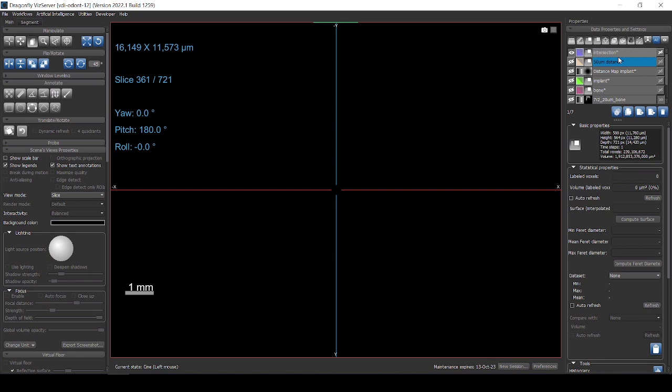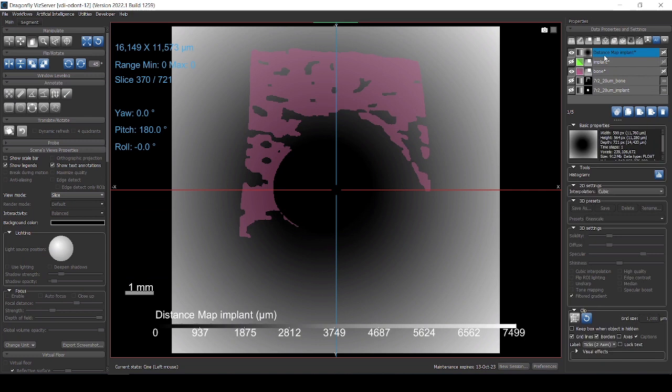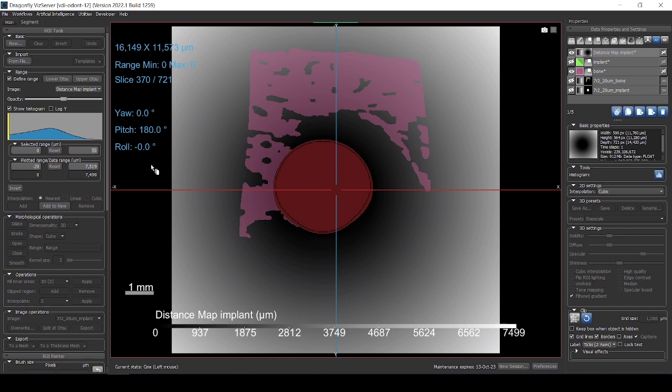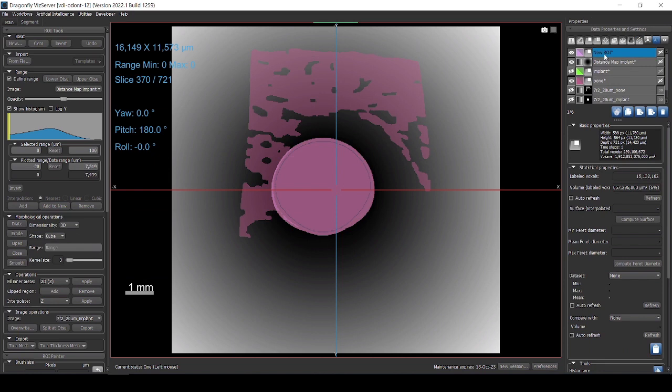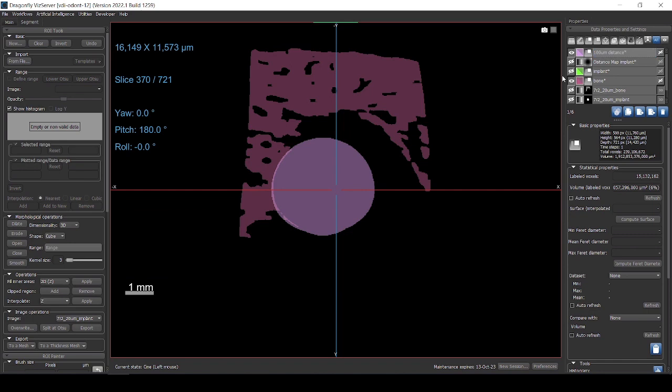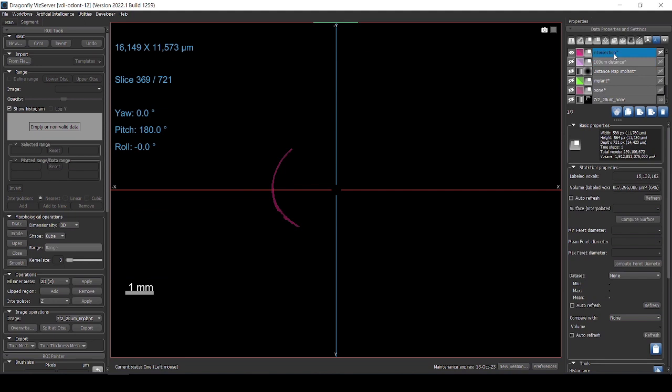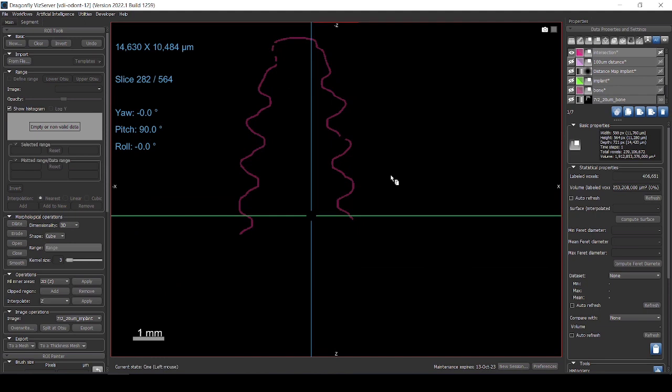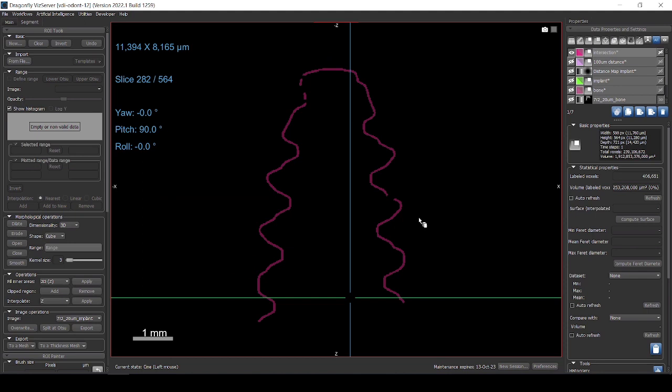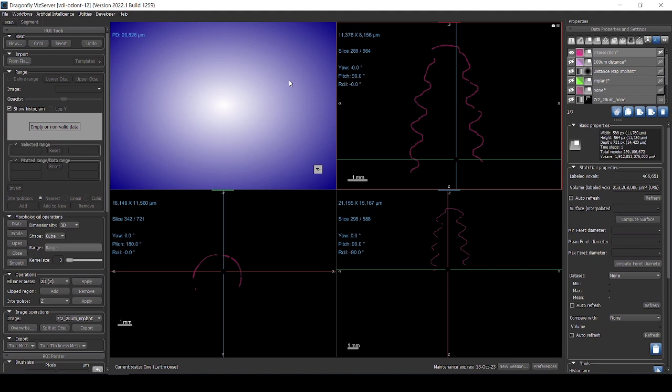Okay, let's try and do a distance map. Go back to segmentation and let's select 100 micrometers, a little bit larger. So this is going to be my 100 micrometer distance. And then I don't need this anymore. Now it looks like there is a bit of intersection. And I'm going to do again the intersection. There you are. So that was really not enough, the 50. So now if we look here, we've got enough intersection. So 50 was very little. And we can see that there is no bone in this area. It could be some pore of the bone or some gap. So that is what we're aiming for.